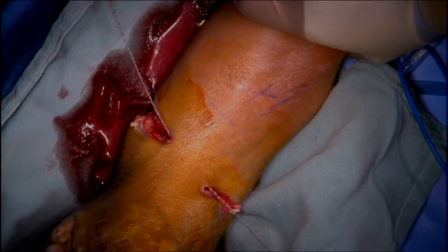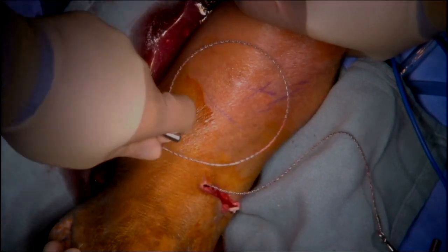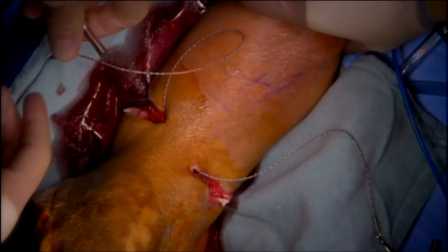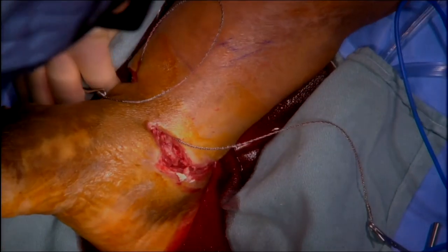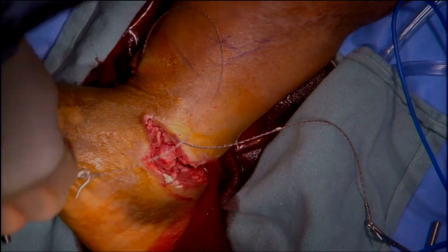During this maneuver, the surgical assistant applies manual pressure on the popliteal artery to help minimize bleeding.